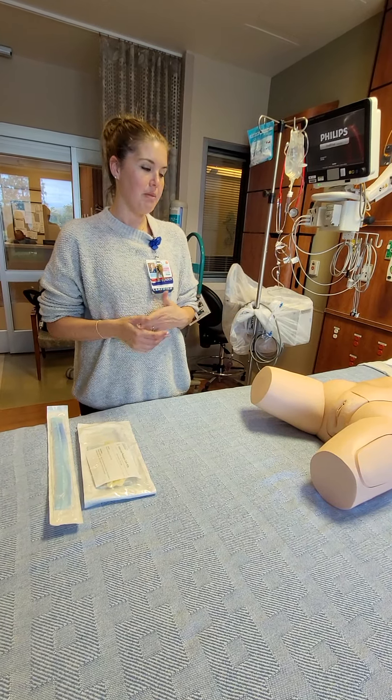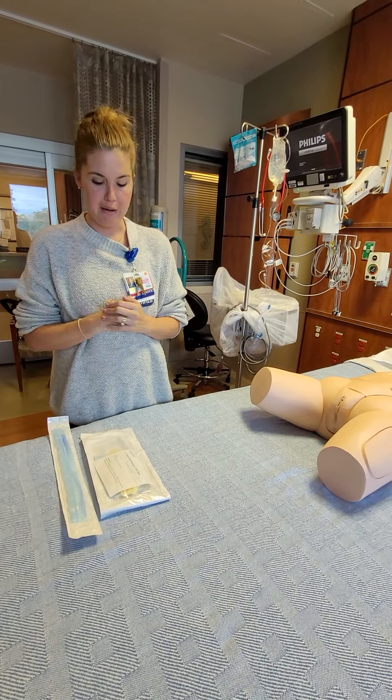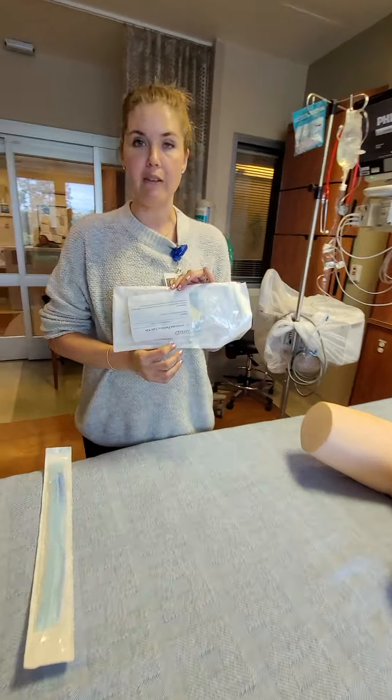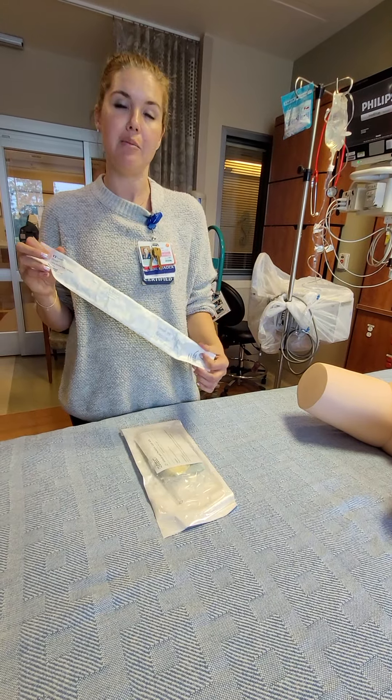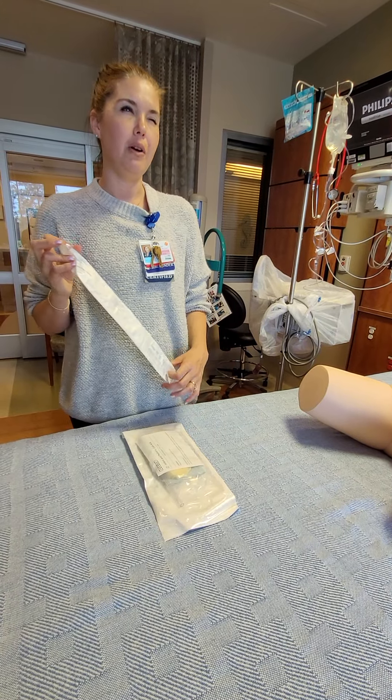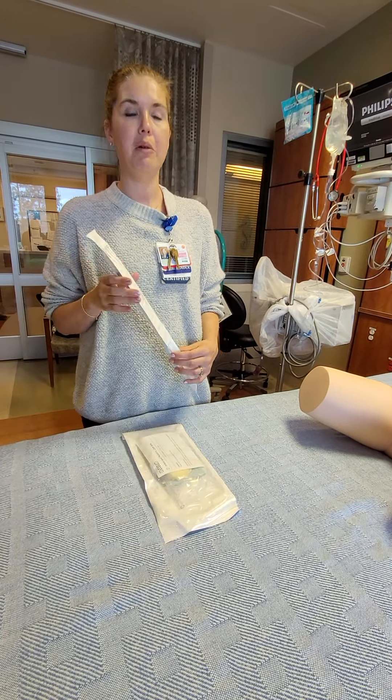Before you go down, go into our own supply room, because they won't have these downstairs. You're going to want a basic infant or pediatric in-and-out cath, just depending on the age of the patient you're working with. And then you're going to want a Foley. For the purpose of this, I'm grabbing a 10 French, but for any of the infants I would grab a 6 French. Anyone over 2, I would probably grab an 8.